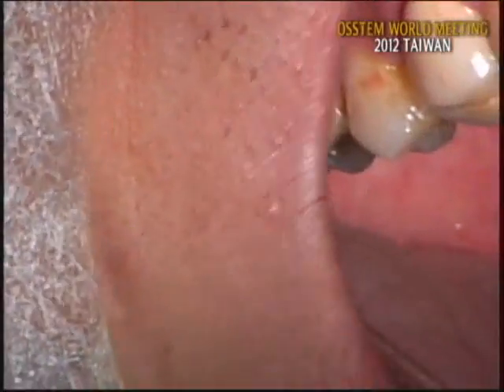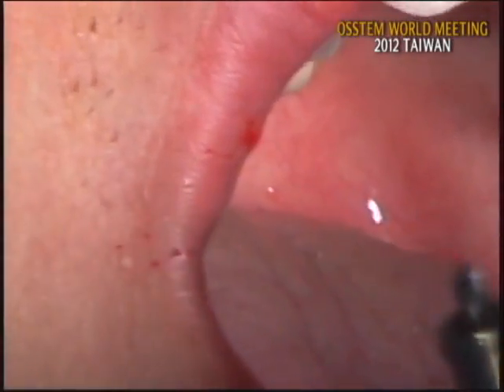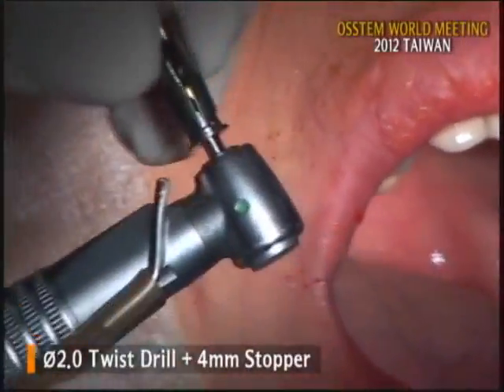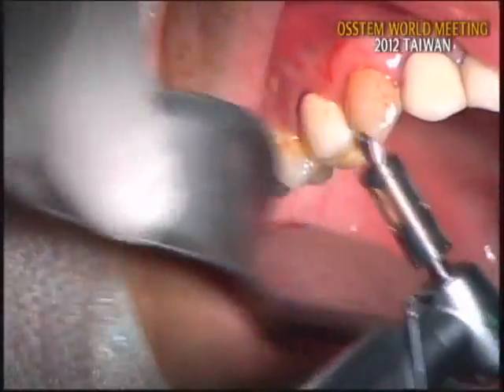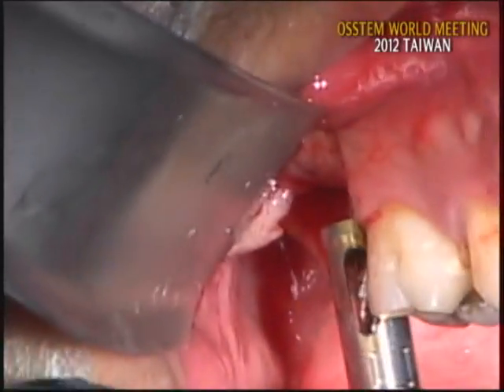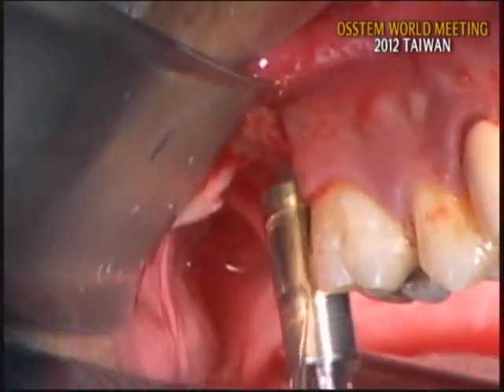So I will start with the 2.0 twist drill, and I connected a 4 millimeter CAS stopper. Sometimes it is better to connect 3 millimeters for safety, but I'll try the 4 millimeter stopper. This is a 2.0 twist drill with a 4 millimeter stopper. The speed of the drill is about 800 RPM.